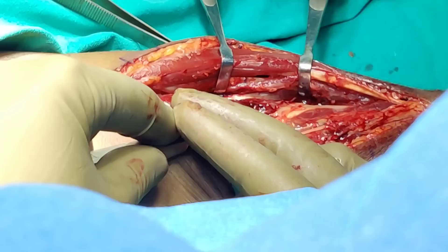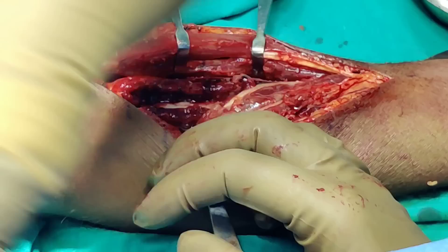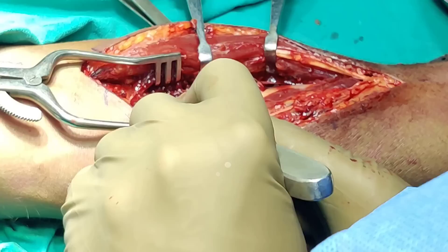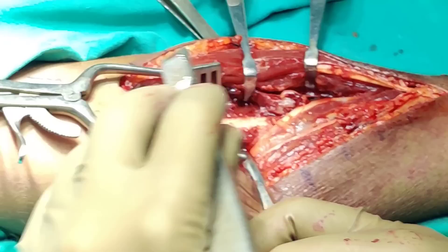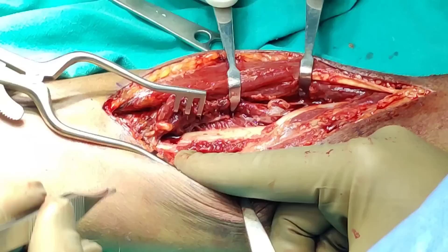Just use the periosteum elevator and try to reflect it. We can now start seeing the proximal aspect of the radius. If I put a self-retainer there, you can see all of the proximal radius — we are very, very proximal. Even if the fracture were slightly more proximal, you should be able to place a DCP. This is your approach to the proximal radius. You can see the elbow joint right here, and you can see the head of the radius.